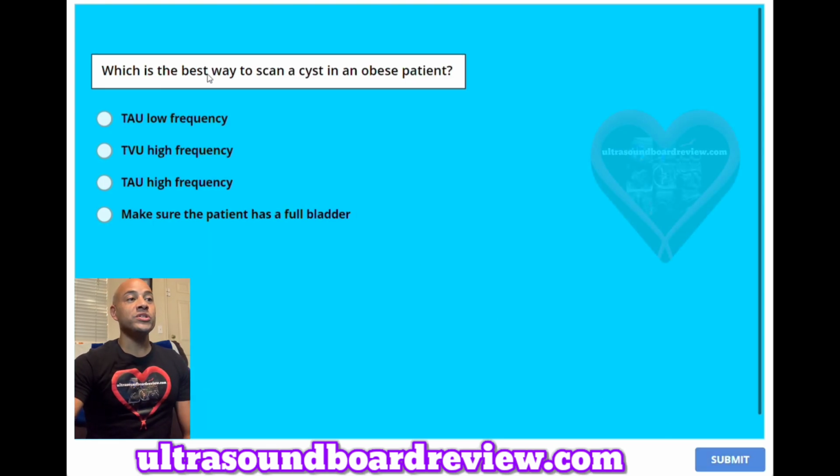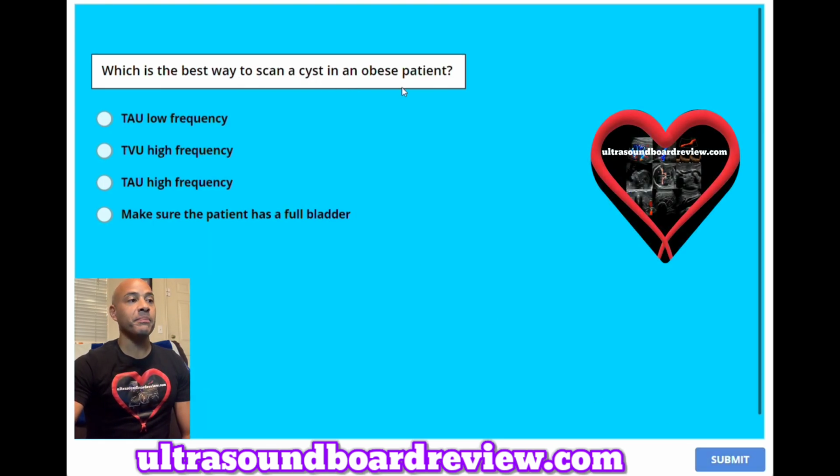Question 14. Which is the best way to scan a cyst in an obese patient?